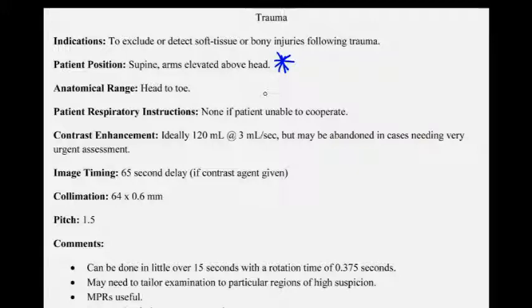and commence the scanning. The anatomical range is going to be head to toe, which is slightly a little longer than what I would actually consider. Many times, based on the type of algorithms that need to be utilized, scans will be grouped into smaller segments. But in theory, it can be performed in terms of CT now, head to toe. But basically, if you had an order come off for chest, abdomen, pelvis CT for trauma, then you would scan from the lung apices down to the symphysis pubis. Things like that would also be applicable.